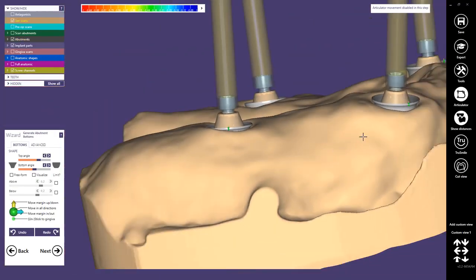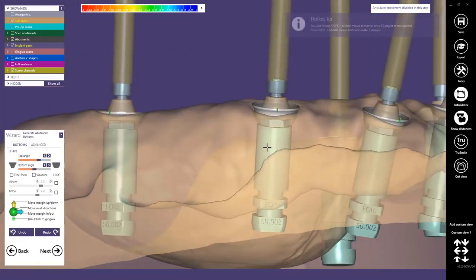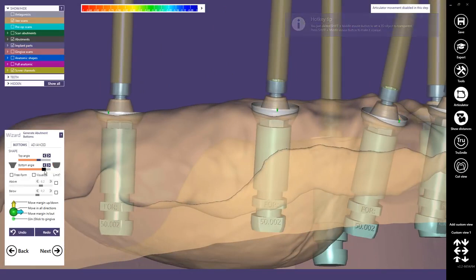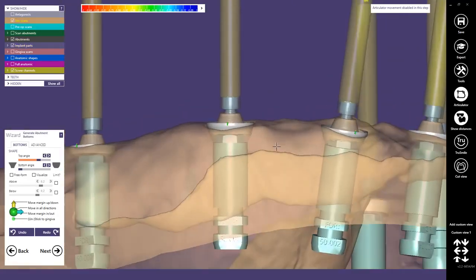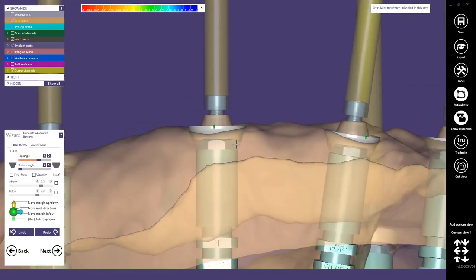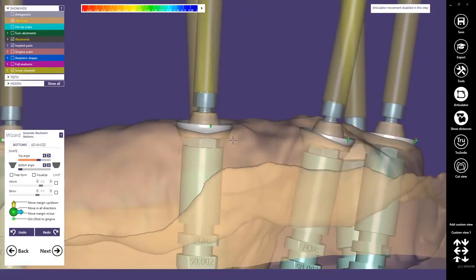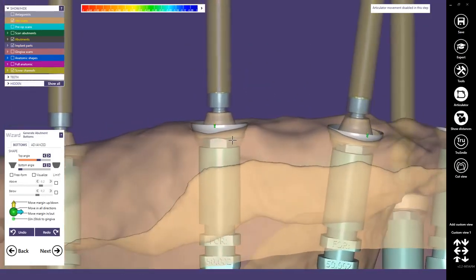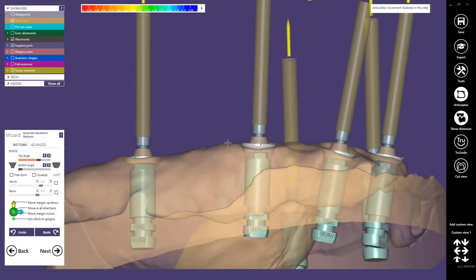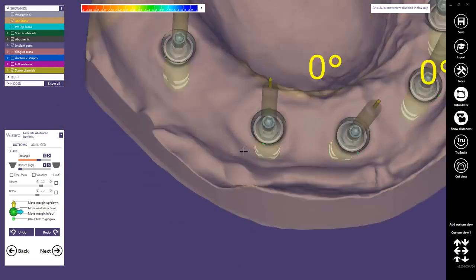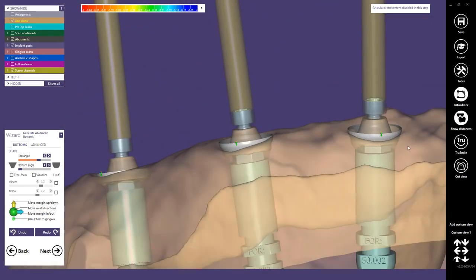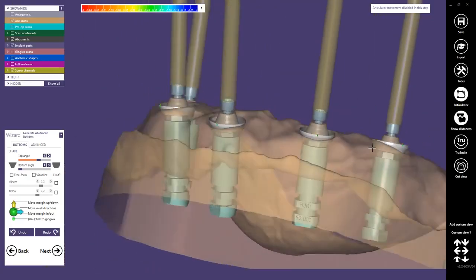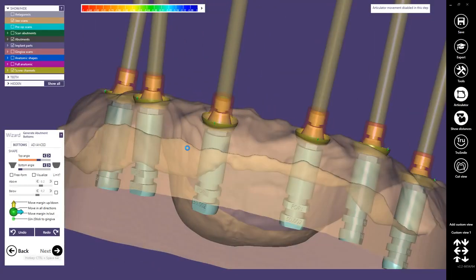Now I just adjust the shape. I use this button to create an entire convex shape and then I use the lower slider to create a kind of concave shape here at the bottom of the emergence profile. That's how I would design them. Let's proceed to the next step.